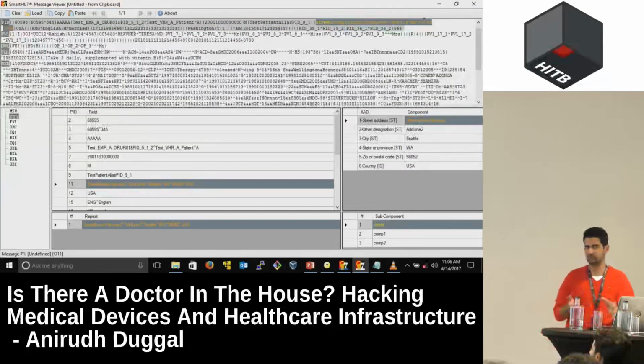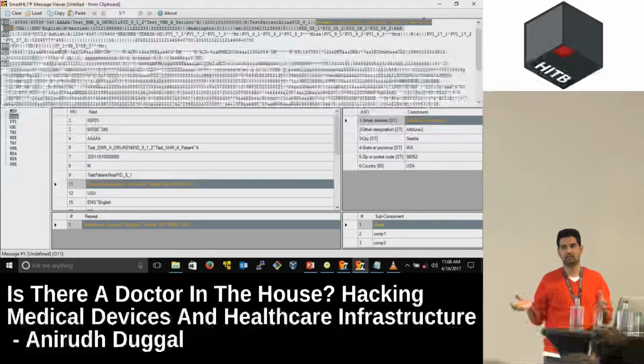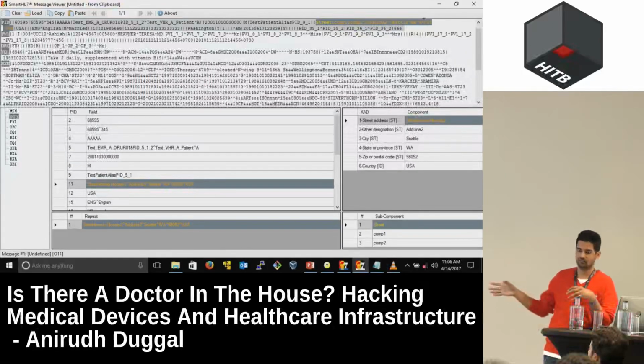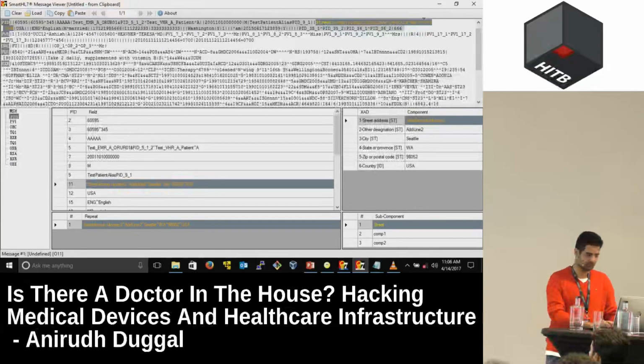If someone comes to you and tells you that we can fuzz this protocol, be a little careful. The other thing with vendors is they would send a very big file and expect the other guy to crash with it, which rarely happens. I have not seen any good crashes with that kind of scenario. There are crashes, but not the ones that I want.